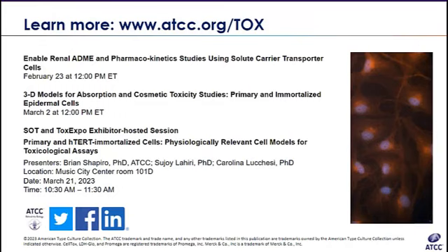The media, from my understanding, should be the same as for the parental cells, but we do suggest that you add about 0.3 micrograms per ml puromycin solution to provide selection pressure. Good, yeah. And that media's SKU is ATCC ACS-4007 if you are interested.